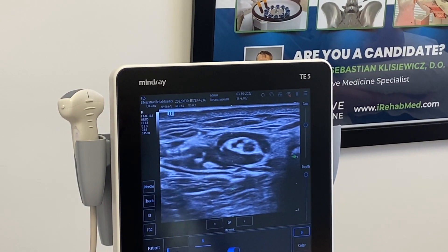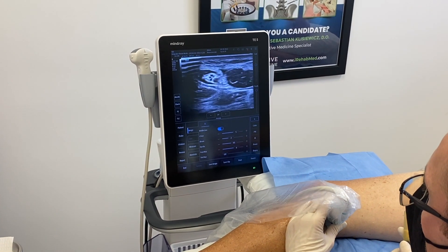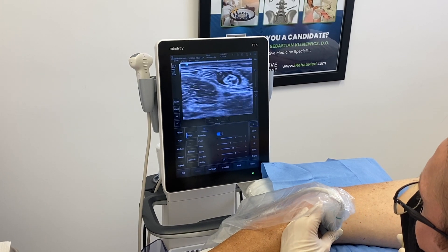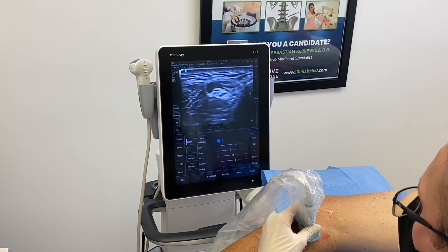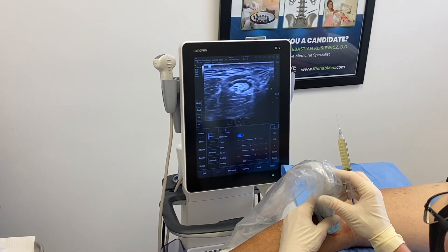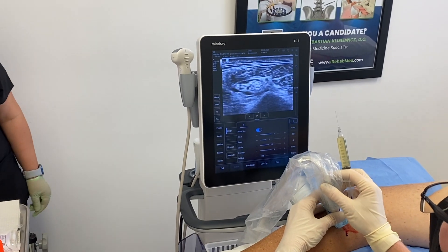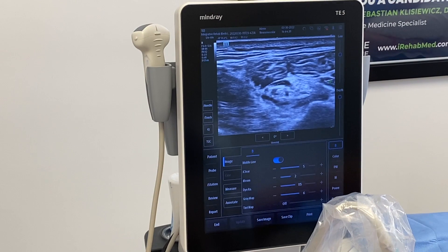The nerve is nicely released right in the middle. I'm going to scan the nerve to see where it is still compressed. Here it is, nicely encircled by a halo of the PRP. I'm going to go down towards the knee and see what it's doing there — and here we're going to decompress it a little bit more towards the knee, putting some PRP around that nerve.